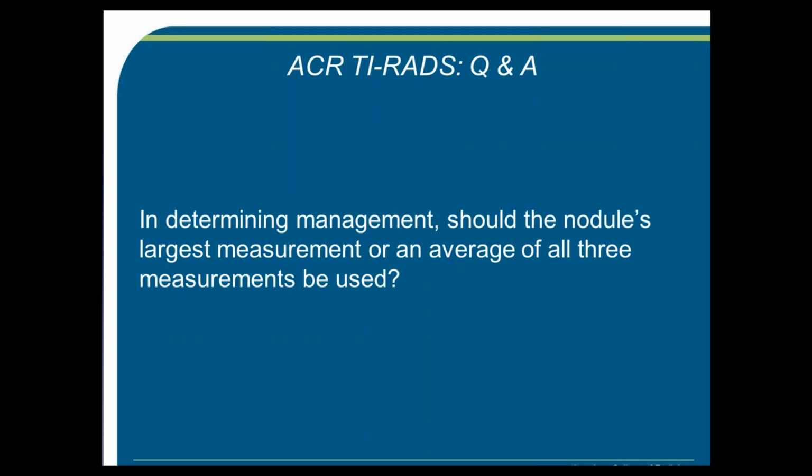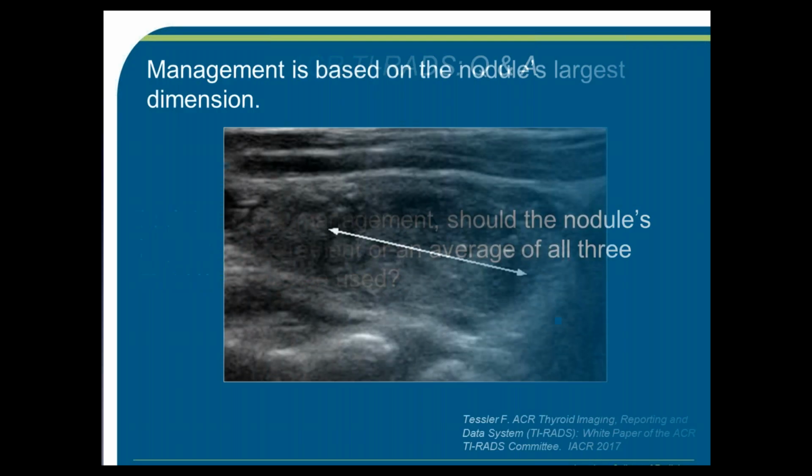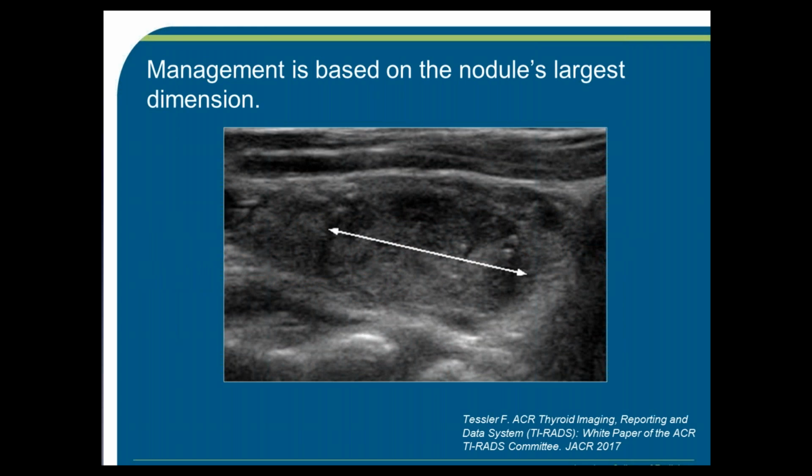In determining management, should the nodule's largest measurement or an average of all three measurements be used? That's an easy one. It's the largest measurement that determines management.